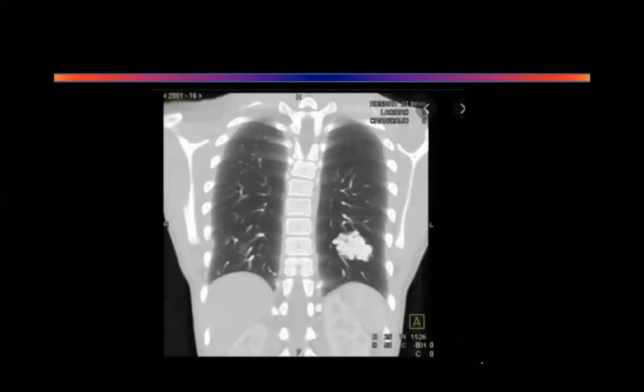Somebody come in quickly. Simran, come in. Simran, did you answer? Come in, take this. Yes, sir. So this is a CT scan in a coronal section showing a multilobulated hyperdense lesion in the left lower. One minute. Stop. What CT scan is this? Contrast and answer. Okay. Anything more than that?